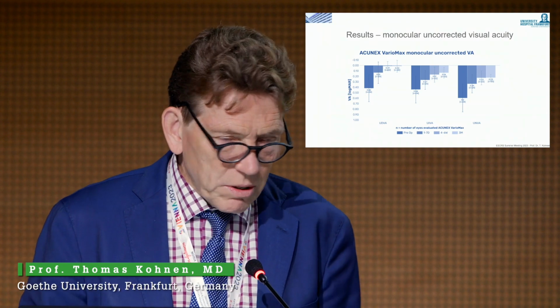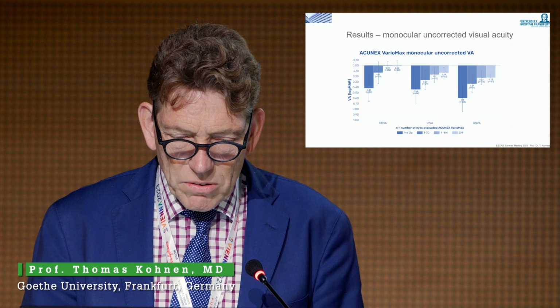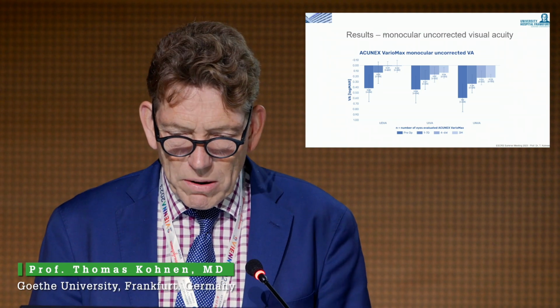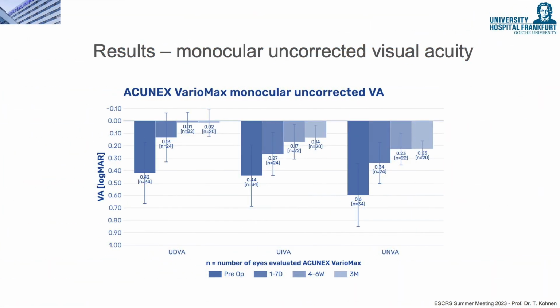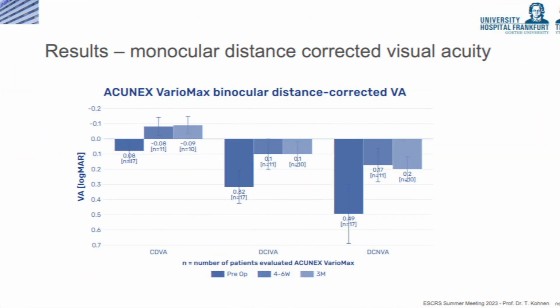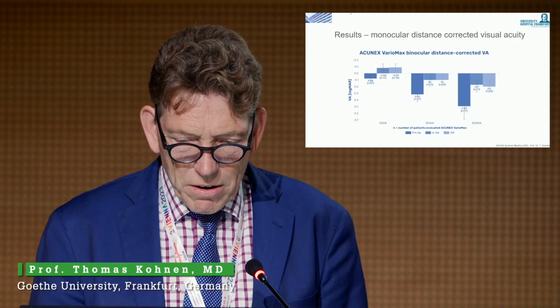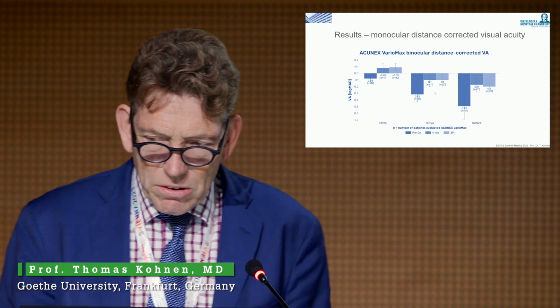So that provides some not perfect data on the first week or on the first days, where we see our patients, maybe some corneal edema. That is, of course, normal, but you can see the most important are the long-term data, let's say 4 to 6 weeks, 3 months post-operatively. This is monocular distance corrected. Corrected usually is better. Let's go back. You can see always this is uncorrected, this is corrected. So if you correct this residual refractive error, you can see still a little bit better. This is a lower number of patients which we have put here together with the bilateral implantation of the lens.